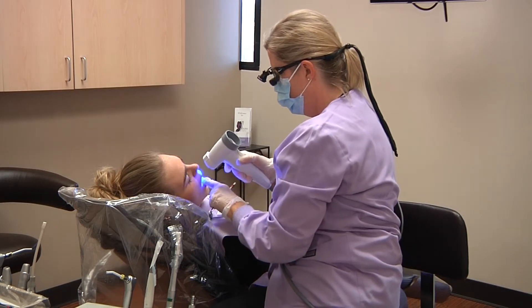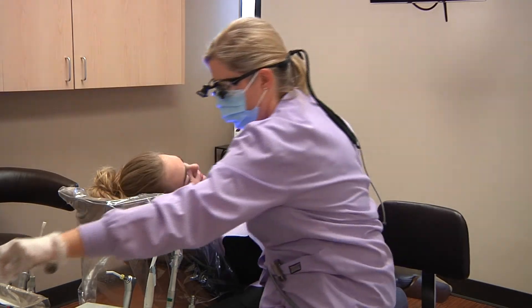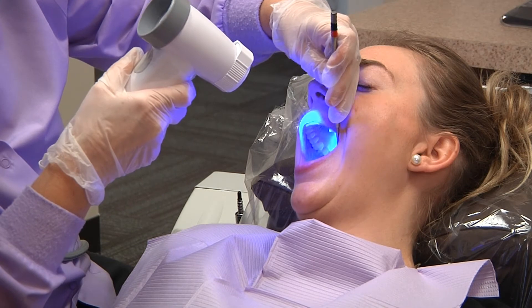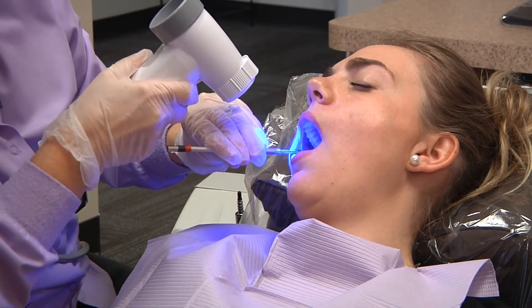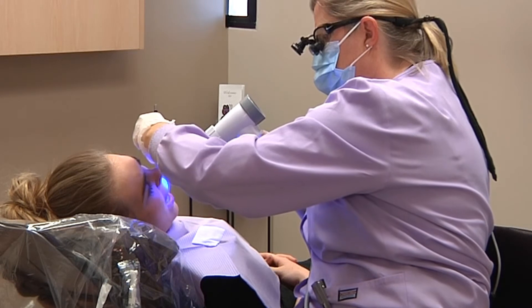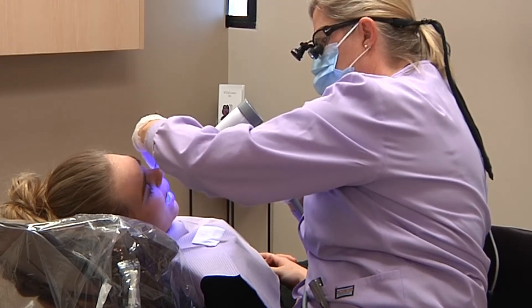And now lift your tongue up. And swallow. I'm going to have you say ahhh. So this way we can view the back of your throat and your tonsil area. Quite often this is an area where we will find suspicious lesions in the mouth. And your palate.